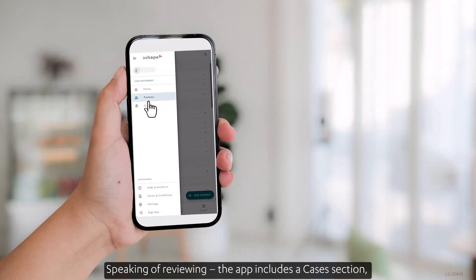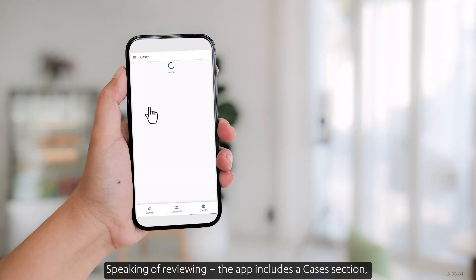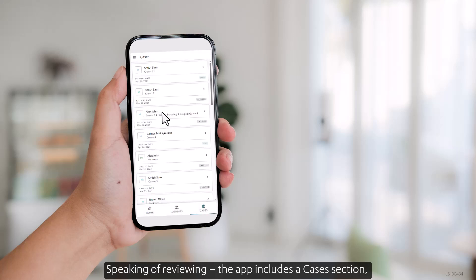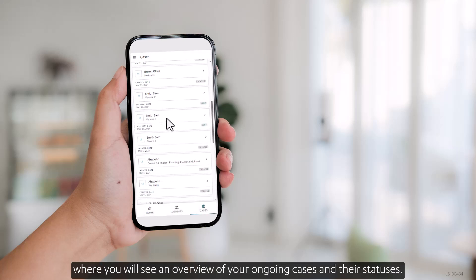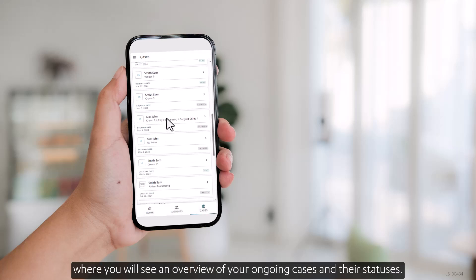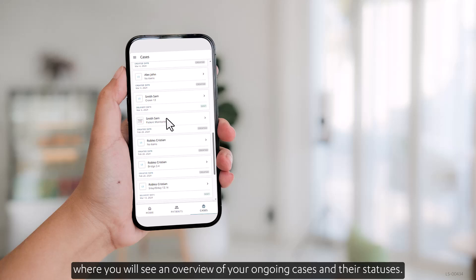Speaking of reviewing, the app includes a Cases section, where you'll see an overview of your ongoing cases and their statuses.